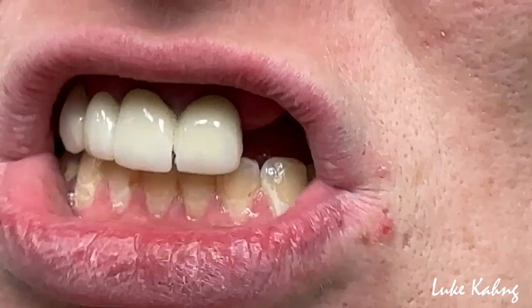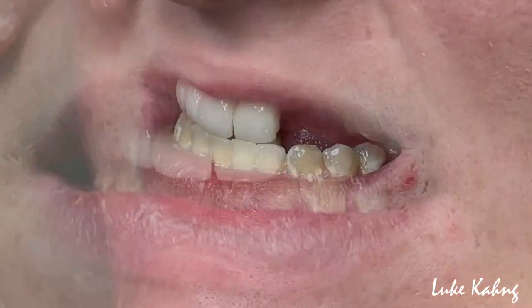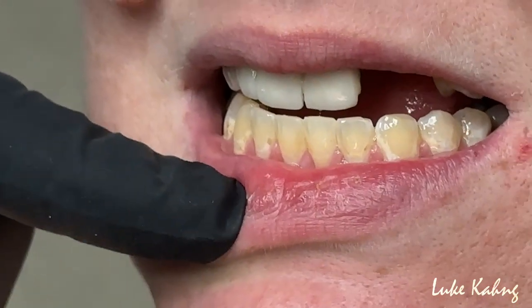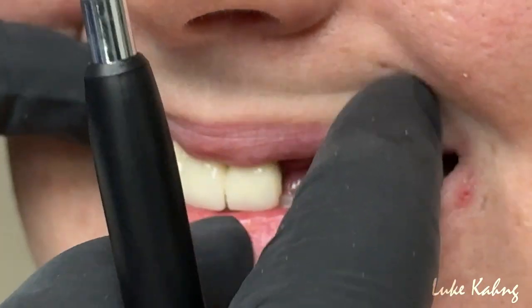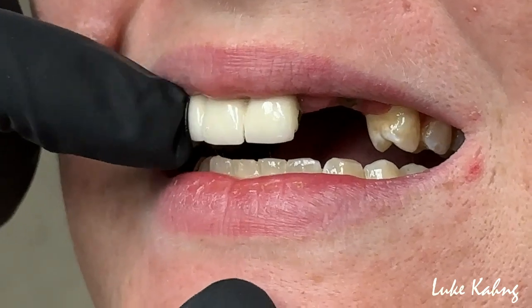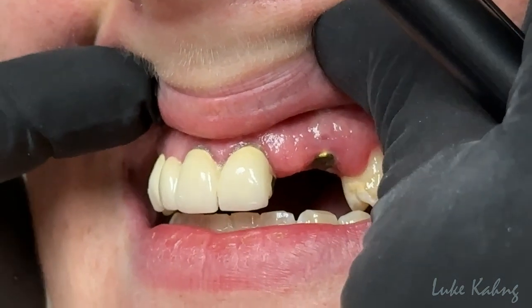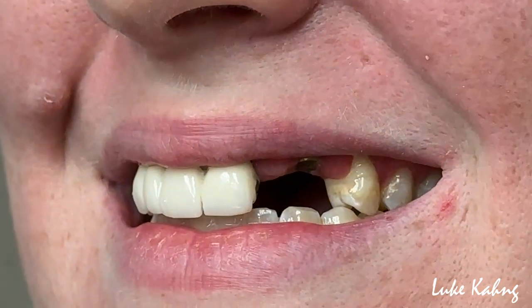I like the midline positioned from the nose horizontally. I can see it's a little bit more between the teeth but I'm not going to move it in there. Chin up — all the way up — I think this is a bit bulky so we can put it back. I'm going to take the tissue color too. All right, cool.